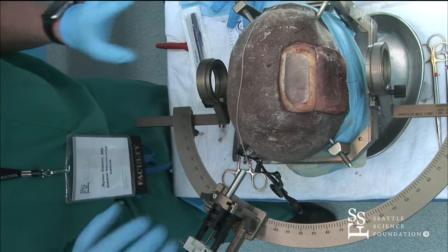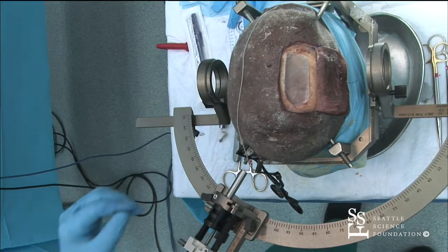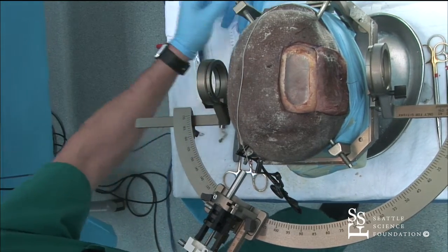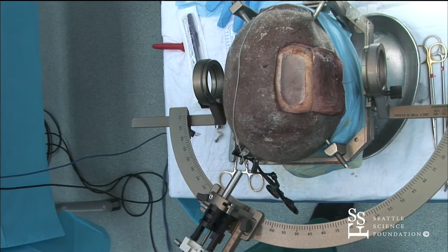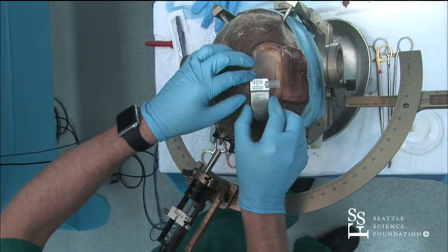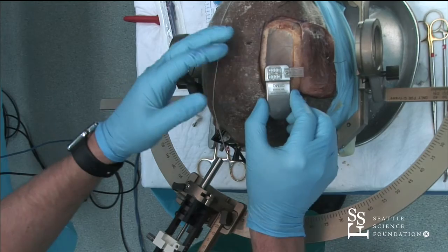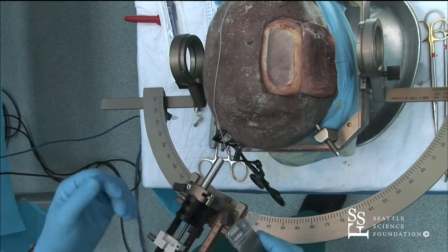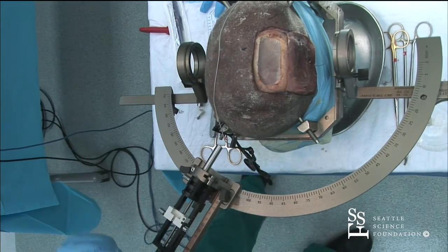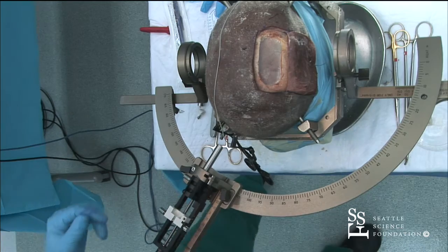So we've already picked a more or less ideal spot. This device has a curvature built into it that was really designed for the parietal curvature of the skull. We're a little bit anterior here, but typically about right here is where we'll end up placing it. You can put it on either side. I usually try to go to the non-dominant hemisphere just in case there's any dural renting. And do we have the template here?